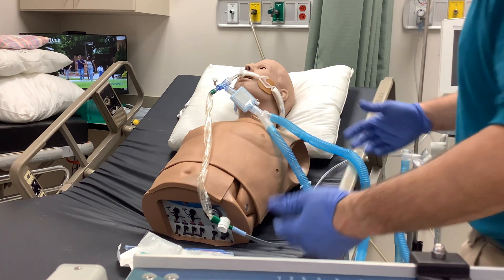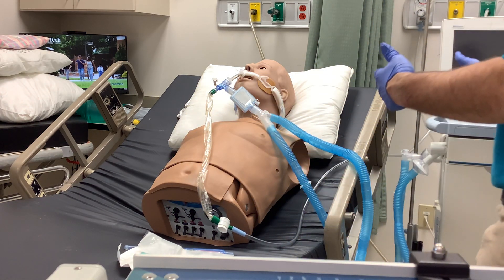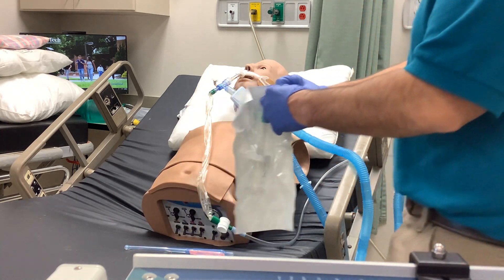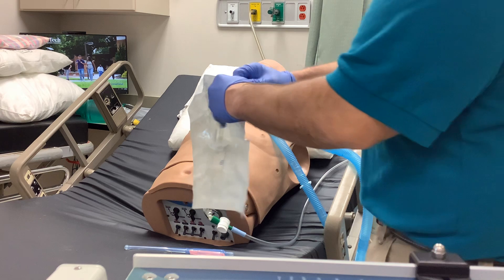With an intubated mechanically ventilated patient, go through and hit your O2 breath to hyperoxygenate your patient. All the while, you can be prepping your Lukens trap.